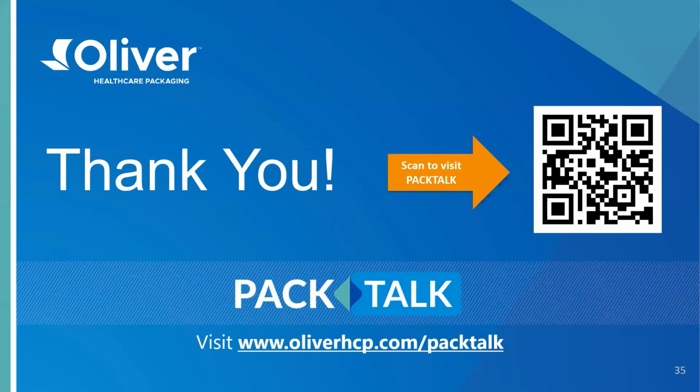Yeah, and just to add to that, Jeff, over the history, what we've learned over the years is that nurses prefer the chevron style pouch in general, simply because of its ease of opening, so that they can easily control that opening without touching the seals upon opening. So from an aseptic presentation, it's a very common design. But as Jeff clearly said as well, and what we've also presented in today's webinar, there are various other different methods and design features available.